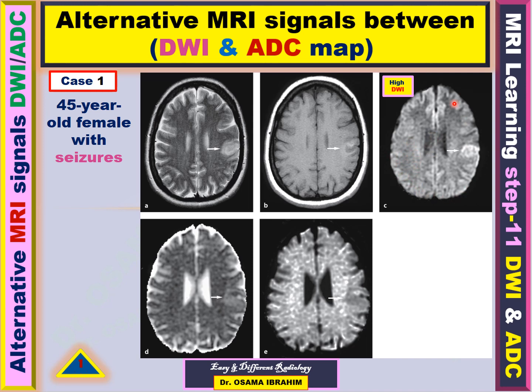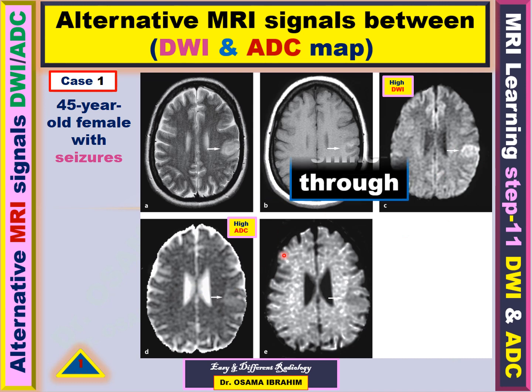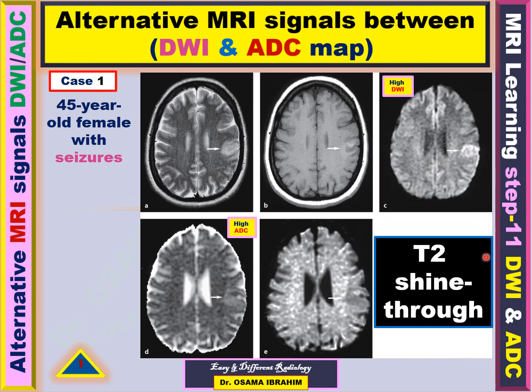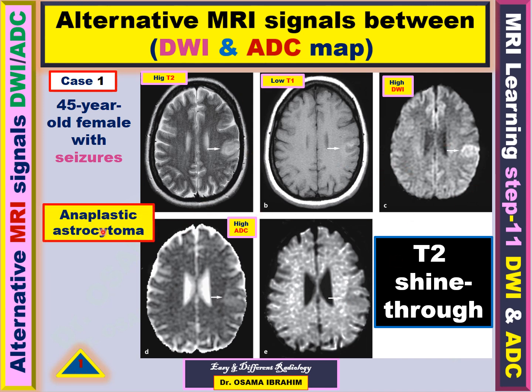This is the diffusion-weighted image, which shows CSF as low signal and white matter darker than gray matter. There is an abnormal high signal in the left parietal lobe. This is the ADC map, where CSF appears bright and the lesions also appear as high signal in the same region. When both diffusion and ADC are high, this is called T2 shine through. The T2-weighted image shows CSF bright and white matter slightly darker than gray matter.